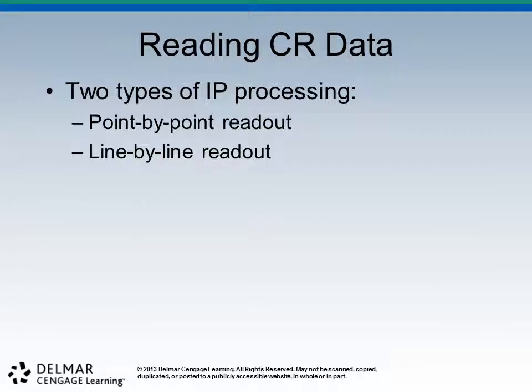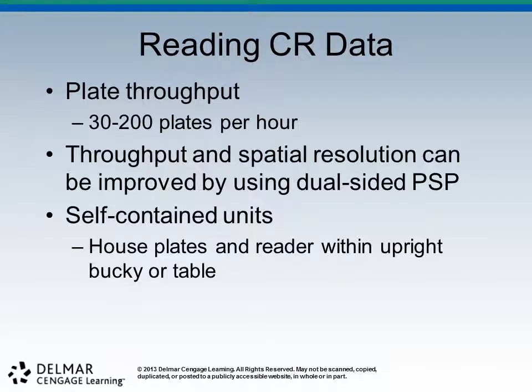All right, so now how we're going to read this data. There are two ways, point by point and line by line. Of course, this is going to be faster line by line. Point by point takes more time, but I would suspect gives us better image detail. And we had this discussion yesterday about how detail sometimes can fundamentally affect the ultimate diagnosis of the patient. So, give and take, folks. Give and take. Money, speed, it's all starting to come together here.